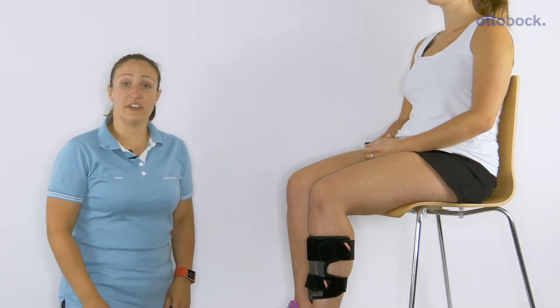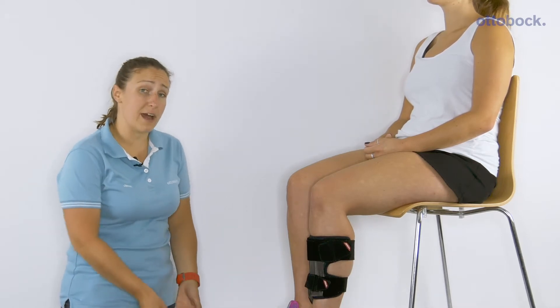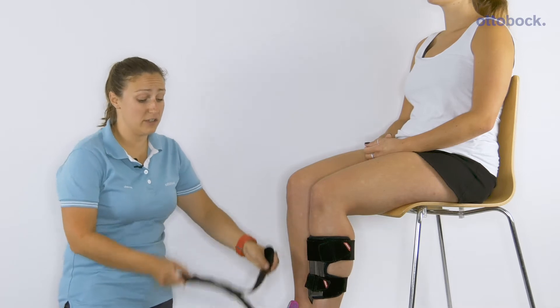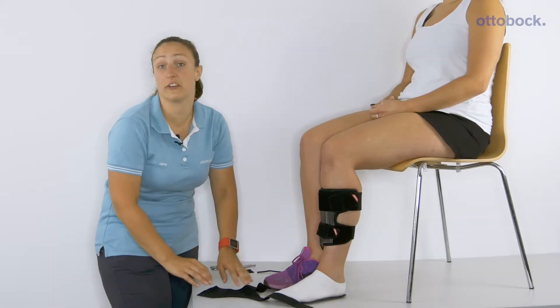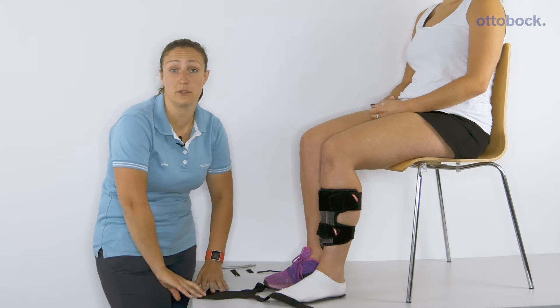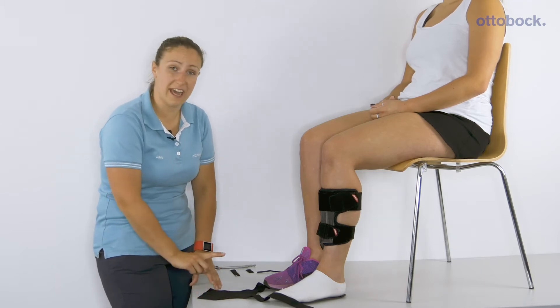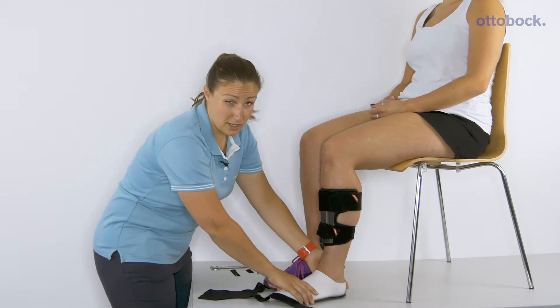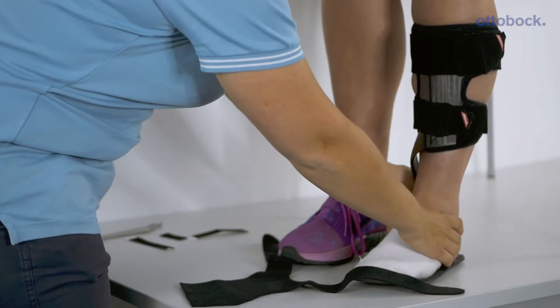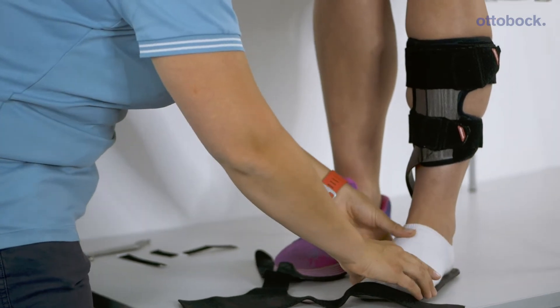With the walk-on reaction, the supination strap comes as standard. If you have a patient who has had a stroke and has some supination in their foot, you can get additional control with this strap. It comes as standard with the walk-on reaction and can also be used with the other braces in the range.